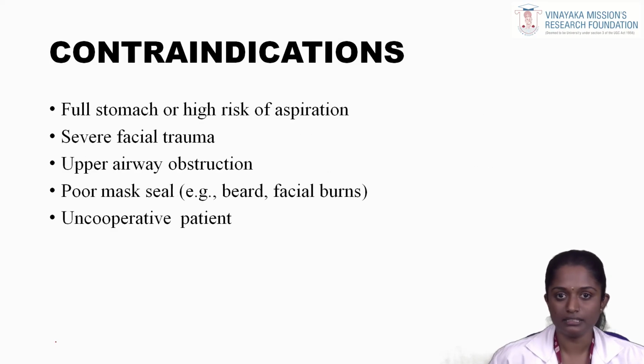Then the contraindications, where we should not use the face mask. First is full stomach or high risk of aspiration patients. Next we will not use it for severe facial trauma, upper airway obstruction, poor mask seal and uncooperative patients. In these types of patients we should not use a face mask.